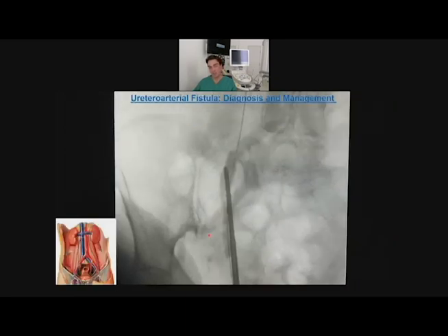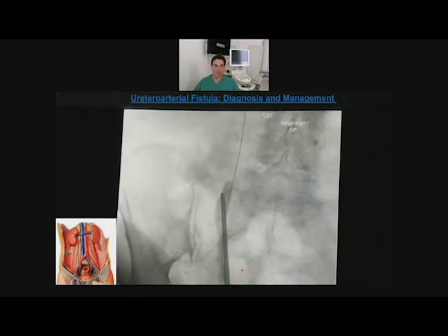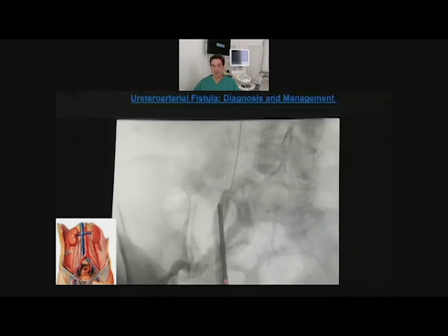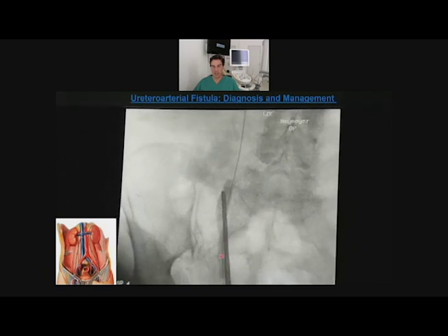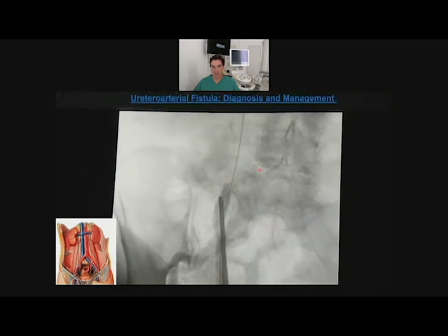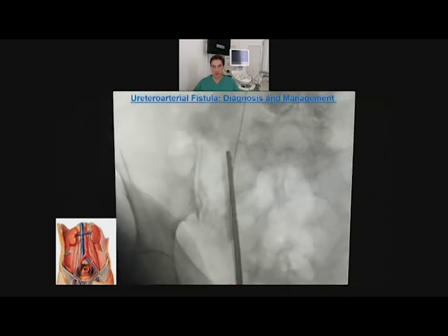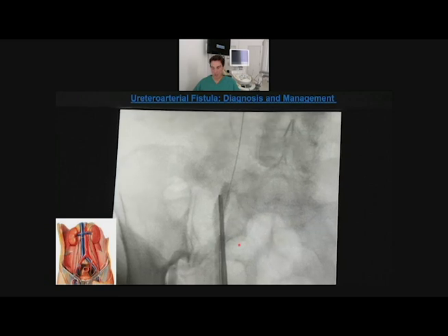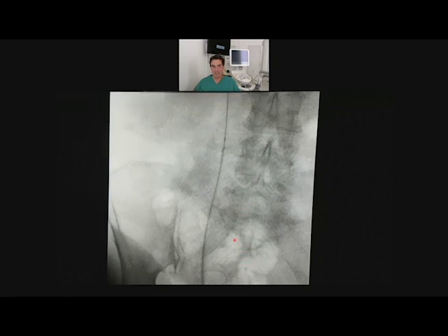Interesting is also that we use it for real complication management. What you see here is a ureteral arterial fistula. My colleague took a stent out, and it was a stent with a stone at the end. And he opened the way to the iliac vessel. It was a big bleeding. I go now with a scope inside, put a guide wire inside, and what we have done is we put the stent inside, now you see it.